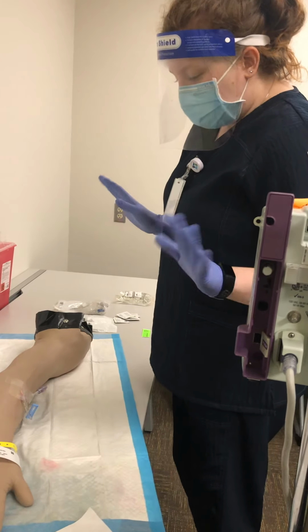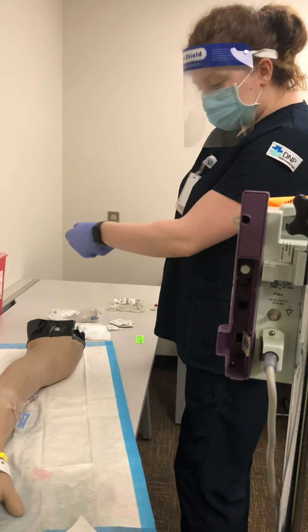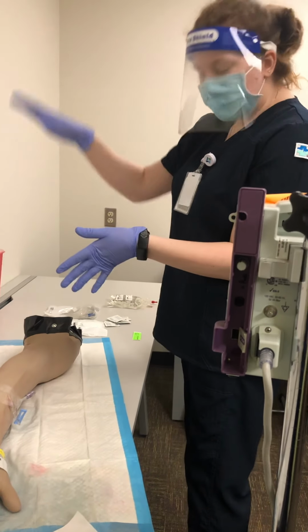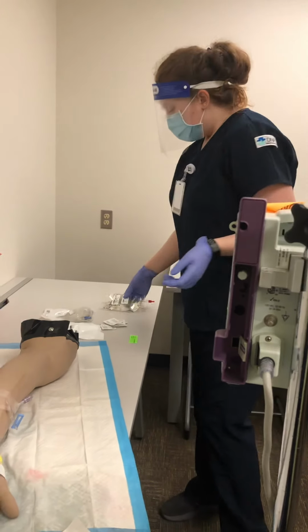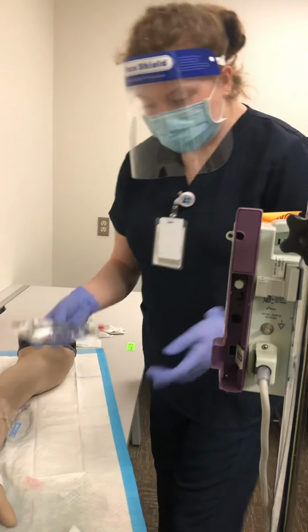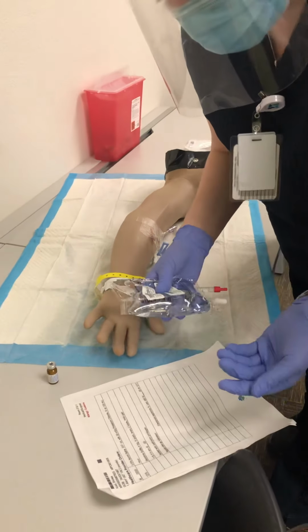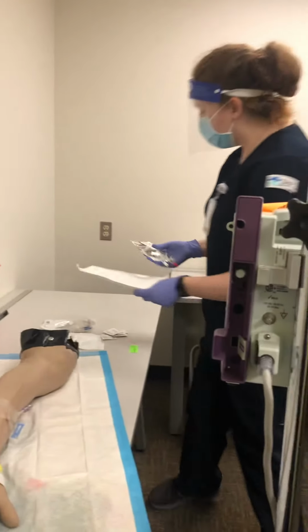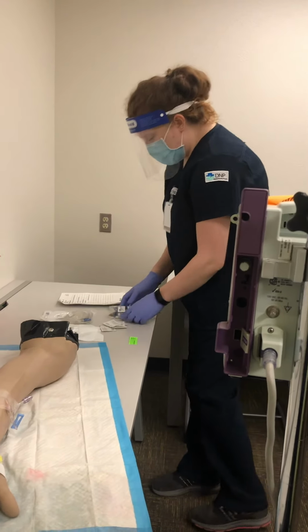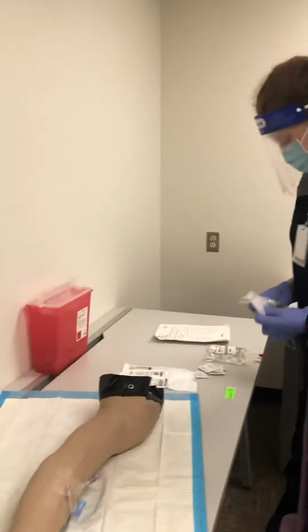I would change my gloves and do hand hygiene because I just touched my hair. And our next part here, we do our 3rd med check for our potassium and our normal saline. So I verify my 6 rights, and they all check out. So now what I'm going to do is get out my IV line.